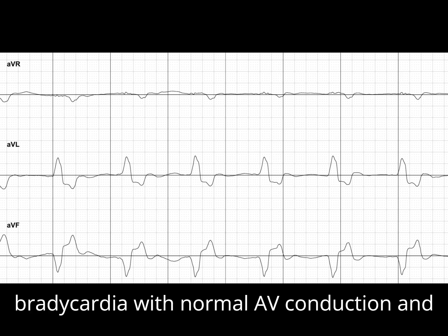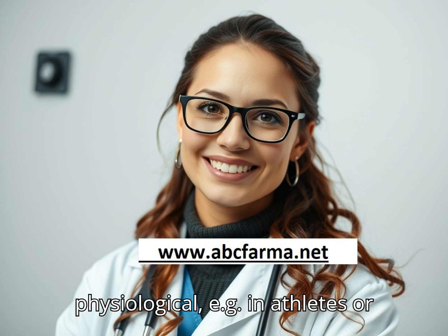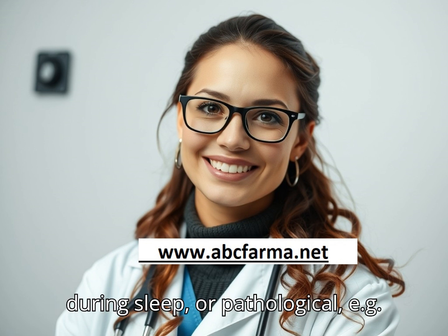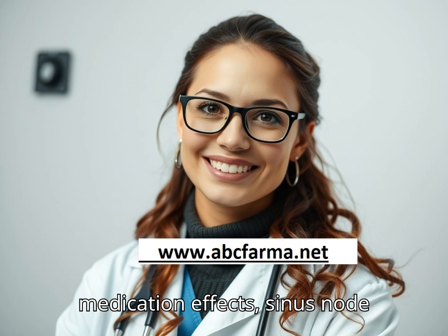Clinical impression. This is a sinus bradycardia with normal AV conduction and no acute ischemic changes. It may be physiological, e.g., in athletes or during sleep, or pathological, e.g., vagal tone excess, hypothyroidism, medication effects, sinus node dysfunction.